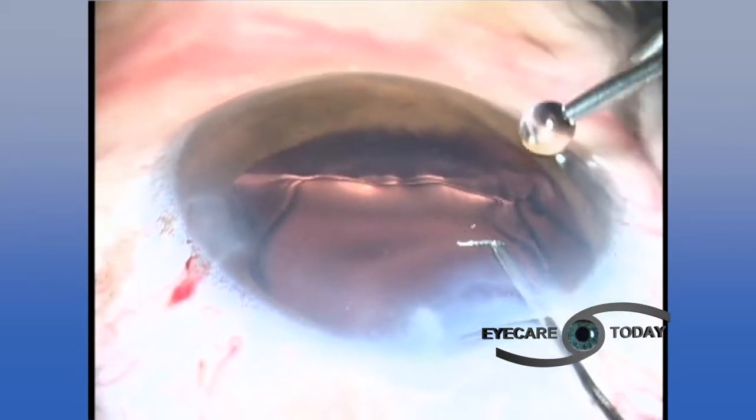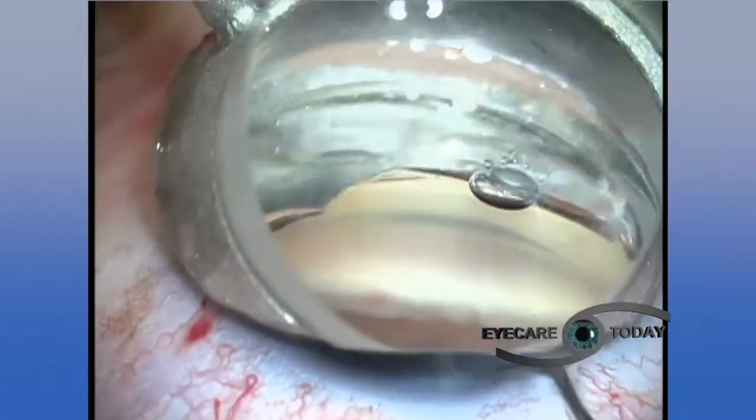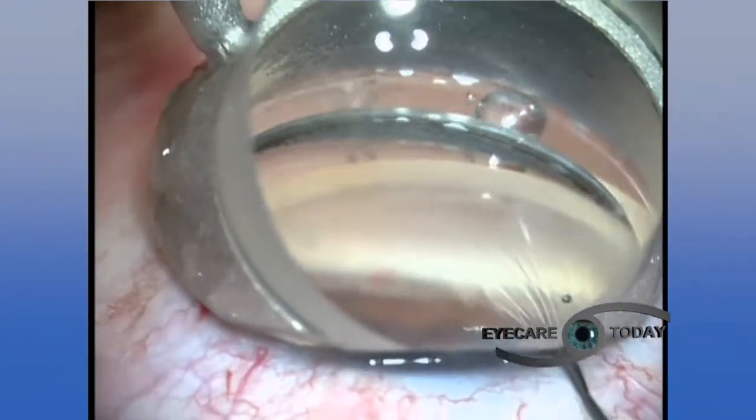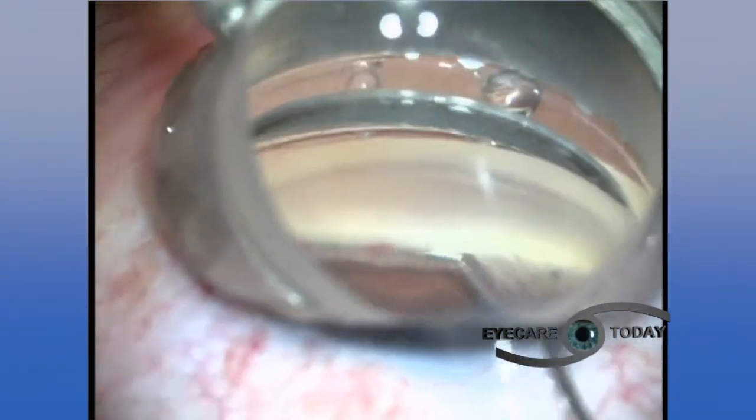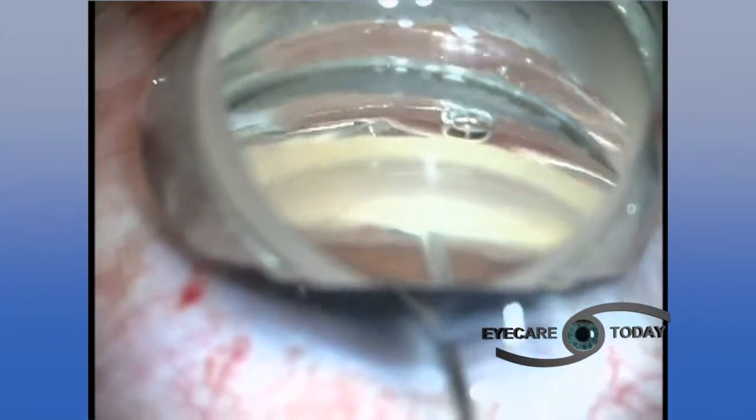And we're lining it up so there's a little bit more of the material that allows us to visualize that special angle. As you saw in the animation, as always, it's a little bit more complex than a real eye.